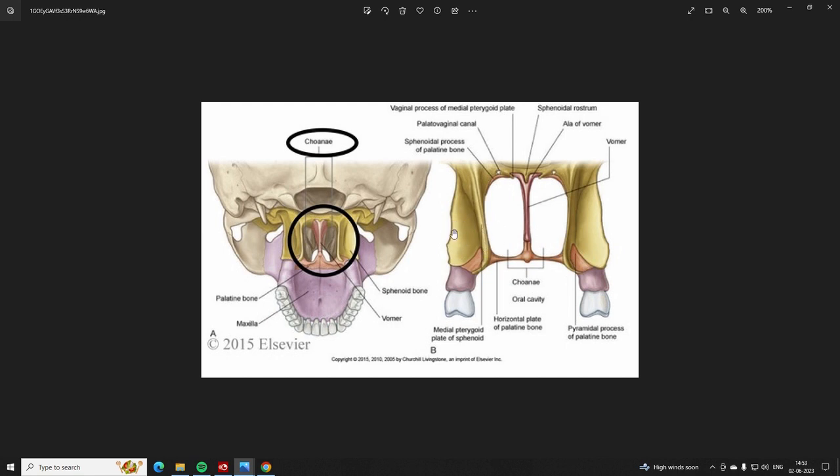So the lateral pterygoid plate, if you see it from posteriorly, you have to think your needle should not go posterior. If your needle keeps going inside, then you are in danger. You may pierce so many complicated structures there. Your needle may go into the pharynx. It may hit the common carotid artery, internal carotid artery. Okay, so the needle should not go posterior.